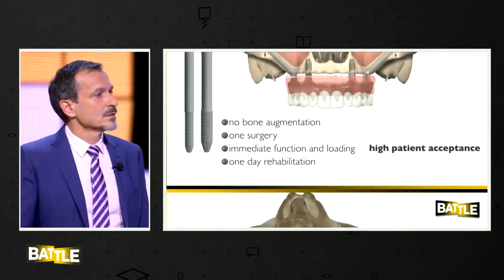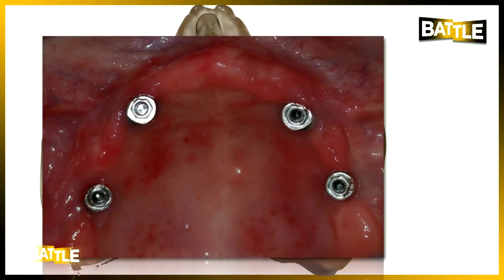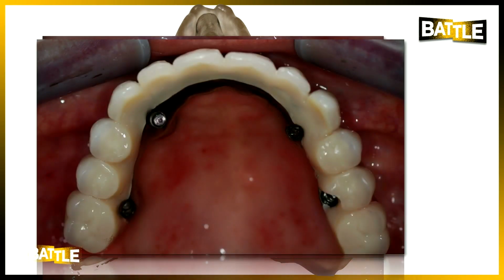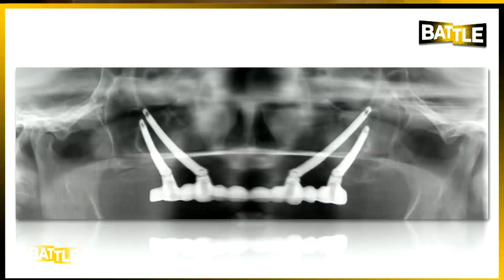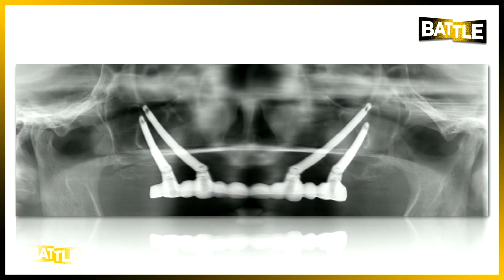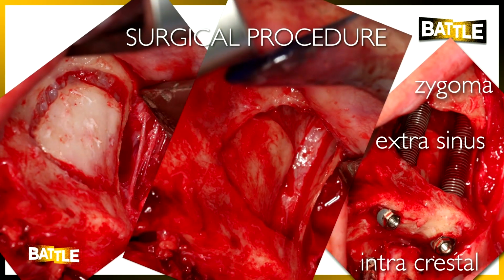If you look now at the layout of the 4 implants, it is a quadrangular layout so that we have a good prosthetic support of the bridge. The technician can produce a fixed bridge, fixed on the 4 implants. We have no limitation of the oral palatal cavity, and in the vertical height we also have good aesthetics and good function. And if you now look at the postoperative radiographic X-ray, we see the concept of the 4 stable implants supporting a bridge.